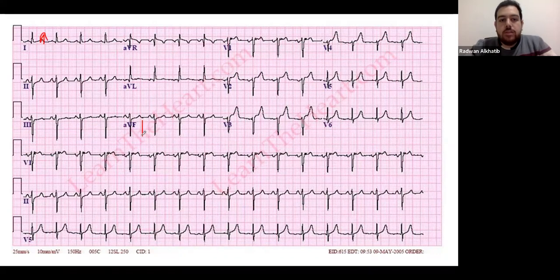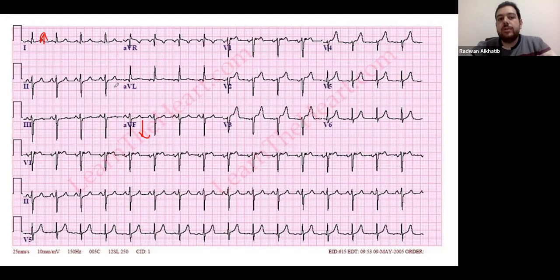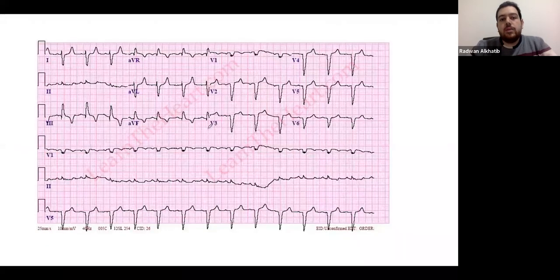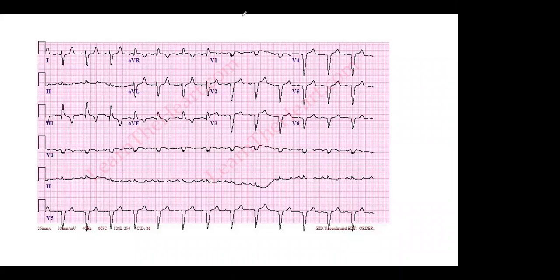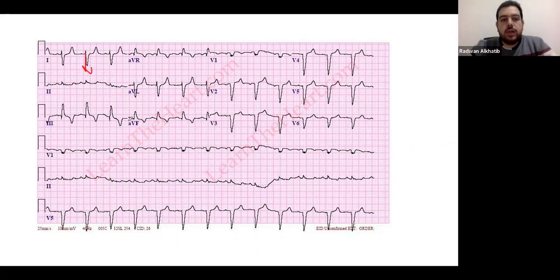Lead one is above the line, and lead AVF is below — they are in opposite directions and have 'left each other,' which is a left axis deviation. For the third ECG, the QRS of lead one is pointing downward and lead AVF is pointing upward. These leads are 'right for each other,' confirming right axis deviation.